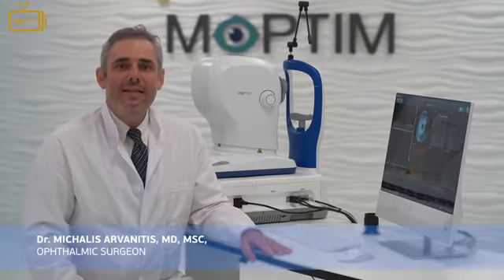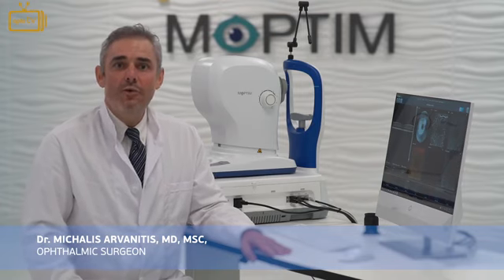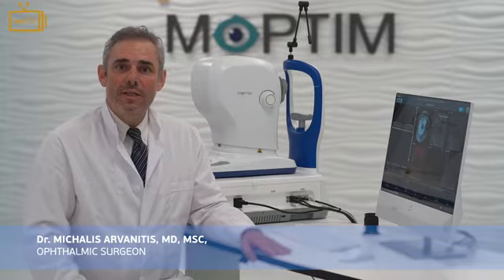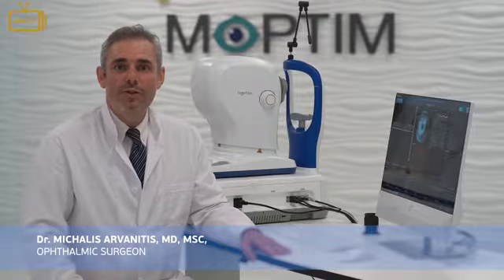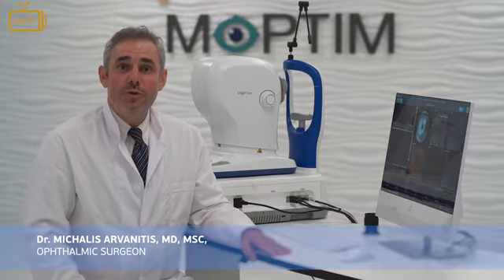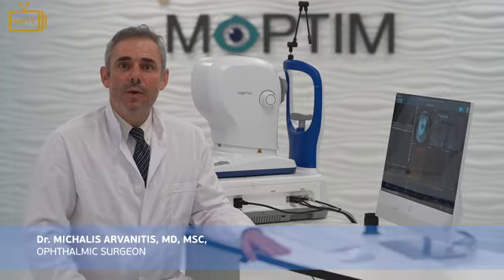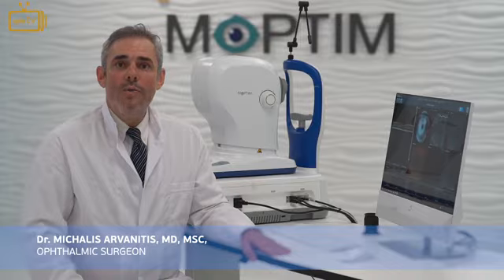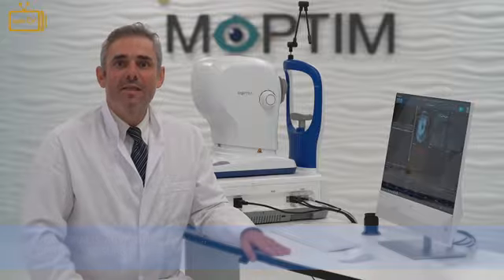We have now completed our demonstration in order to show you all the procedures and the special features of this high-resolution OCT, MOCEAN 4000 OCT with VASCAN optical microangiography. It was a pleasure for me to guide you through all of these procedures in order to acquire very high-resolution images with MOCEAN, and I hope this will help you in your everyday practice in order to obtain very accurate diagnosis very quickly and very efficiently. Thank you.